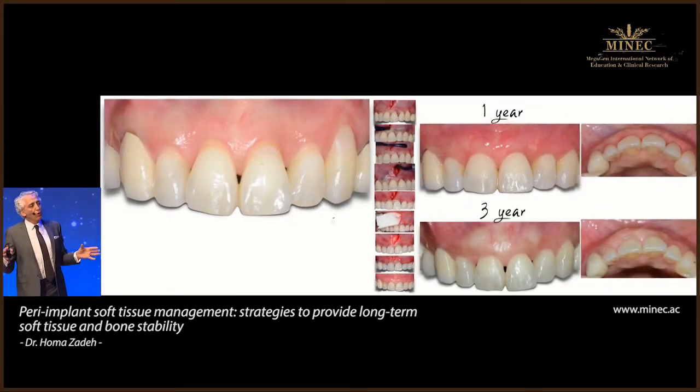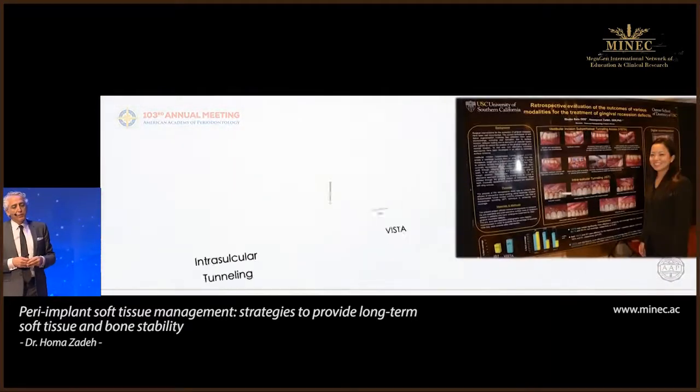But before thinking that we can regenerate papillae, I want to show you more long-term results that the papilla growth doesn't always remain. This is after 3 years. You can see that the midfacial tissue level is very stable, but the interdental tissue, as long as there's not interdental bone underneath there to support it, is not always stable. There are some cases that are exceptions, but generally speaking, that's not something we want to commit to the patient.